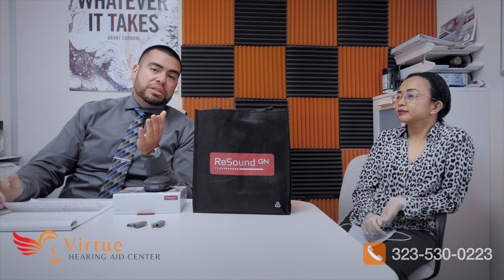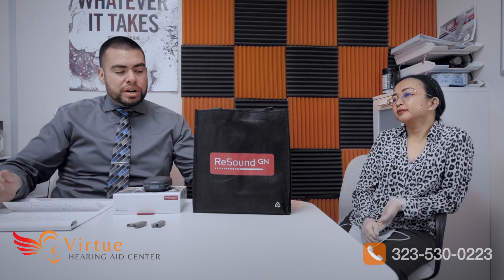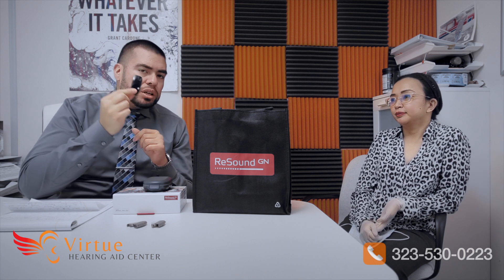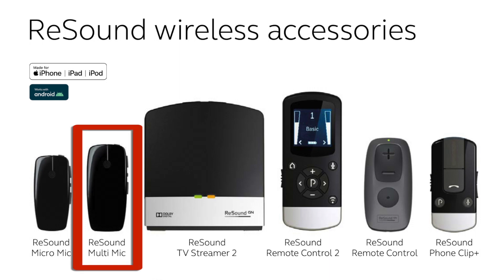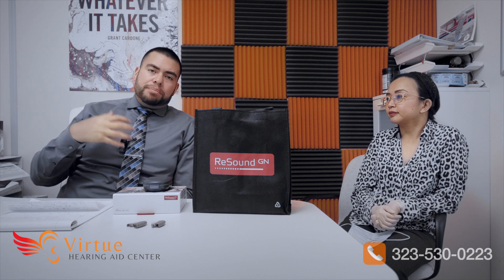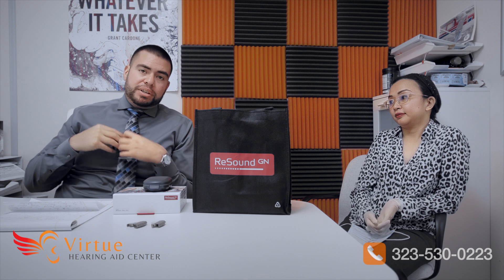There are a bunch of accessories you can use with these. We have the multi mic, which can be used as a remote mic. For example, if you're going somewhere with a speaker, you can give this mic to the person and they can clip it to their shirt or tie. It will stream directly to both hearing aids at the same time.